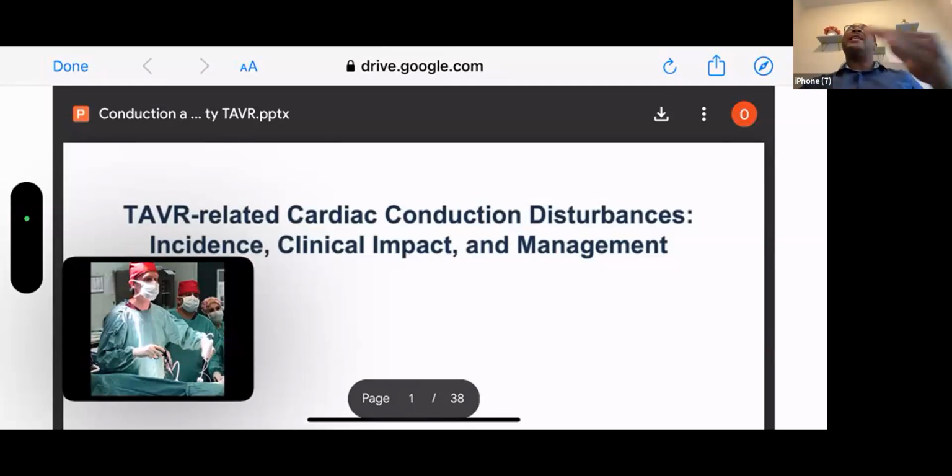And if you look at the evolution, even for coronary stenting, when it started initially, we used to have a CT surgeon in the room, but now we don't need CT surgery anymore for coronary stenting. So my thinking is that in the next 5 to 10 years, we may not even need a CT surgeon in the room for this procedure, because people will have gotten used to the whole thing. The rate of complication will keep decreasing. So right now we use a hybrid room that can do both cardiac cath and open heart surgery.